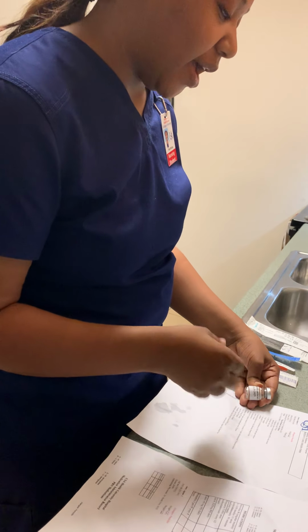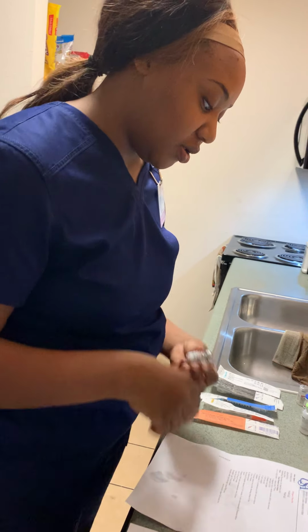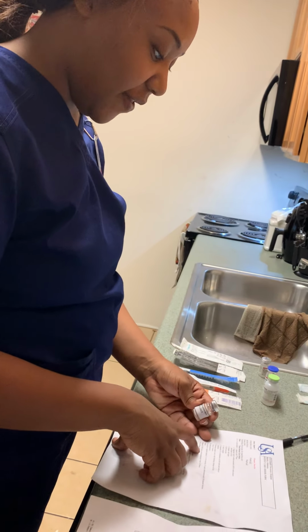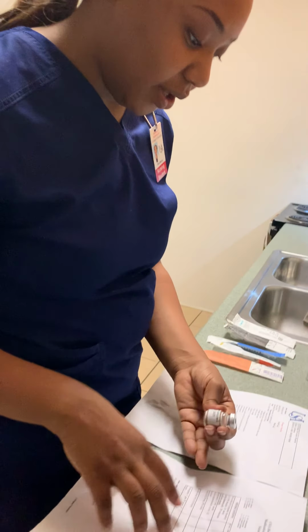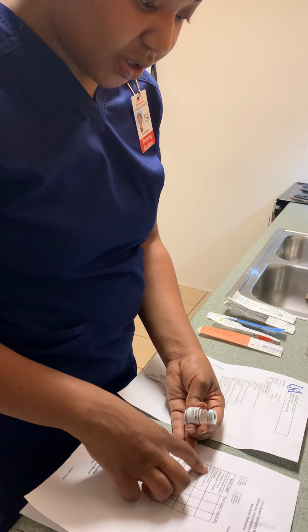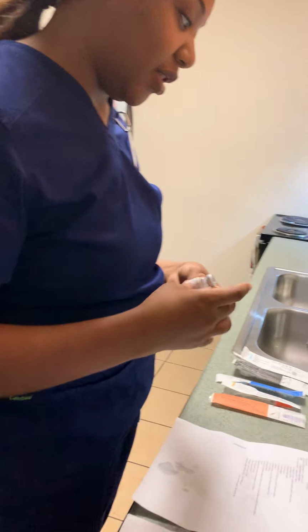So if my calculations are correct, I'll be giving heparin at 0.5 milliliters. So I have heparin at 5,000 units subcutaneously every 12 hours, and I'll be giving it at 0.5 milliliters.